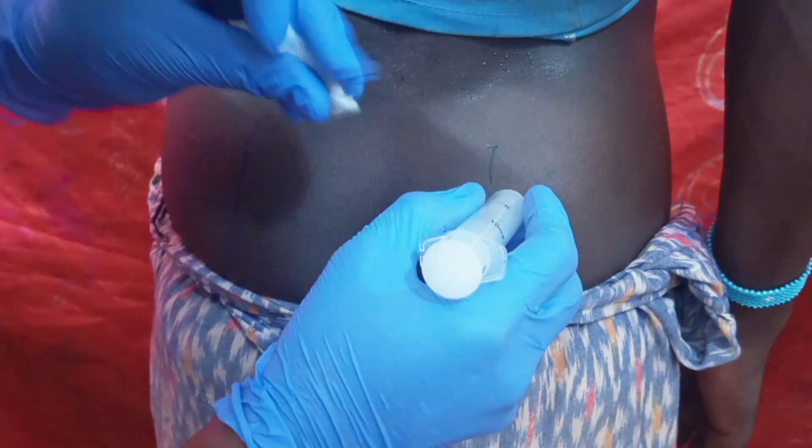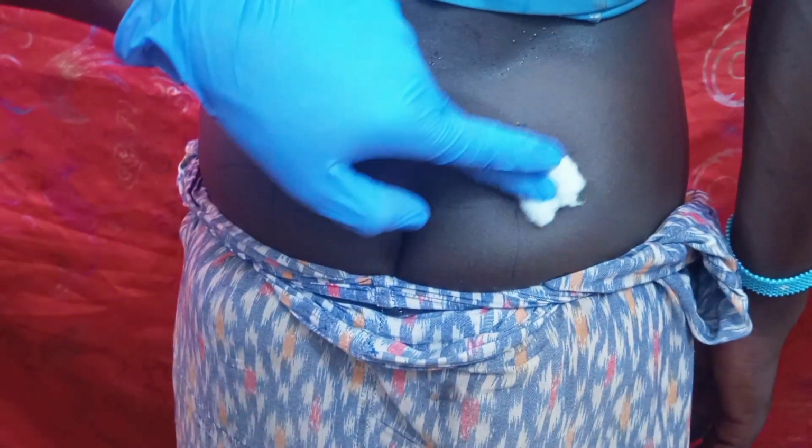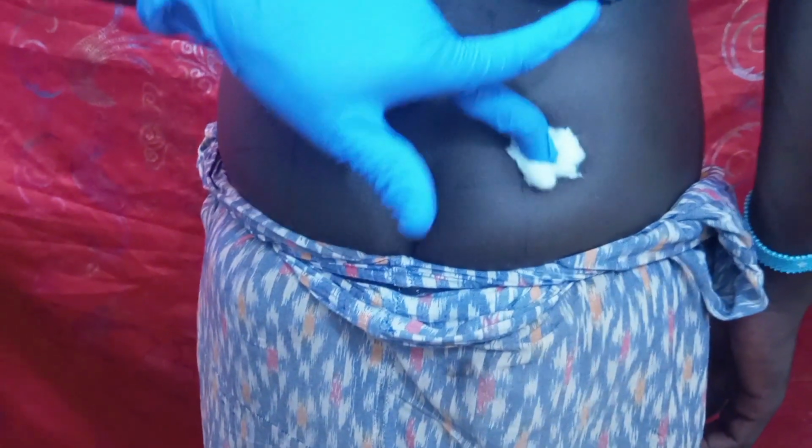Then after you have given the injection, you apply a cotton wool on the area where you have given the shot. So this is how you are going to give intramuscular injection, especially the gluteal muscle.